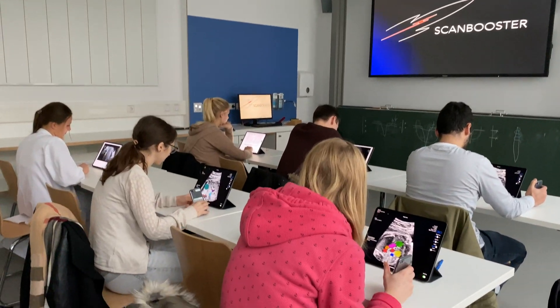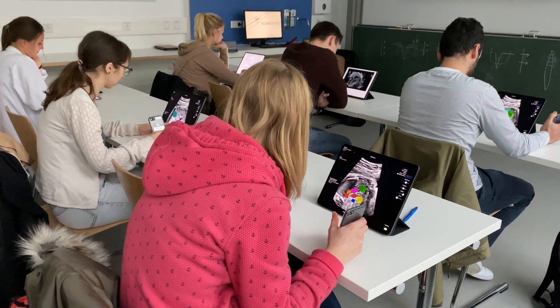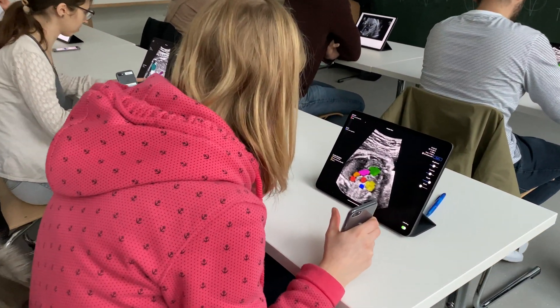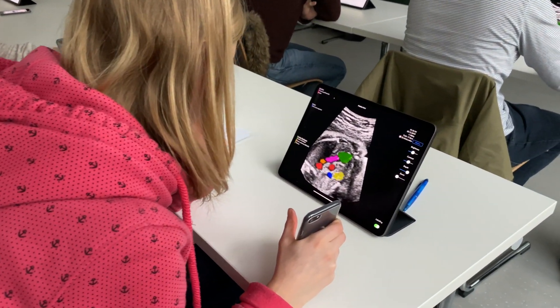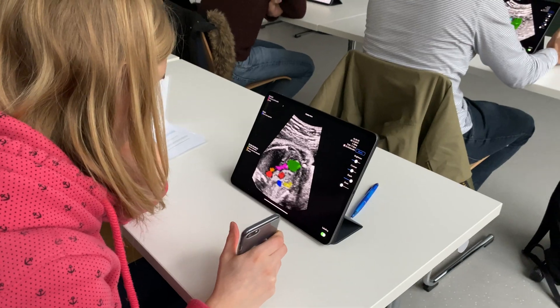Hi, my name is Tim and today I want to show you how to teach your students completely remotely with ScanBooster, the world's first realistic ultrasound simulator app.